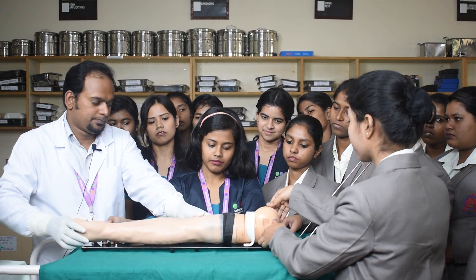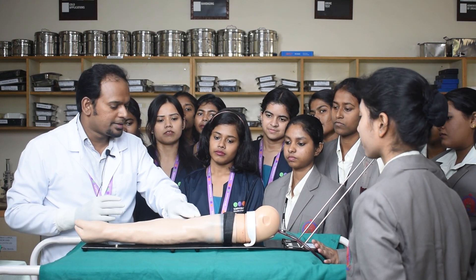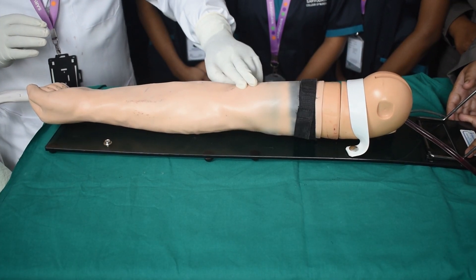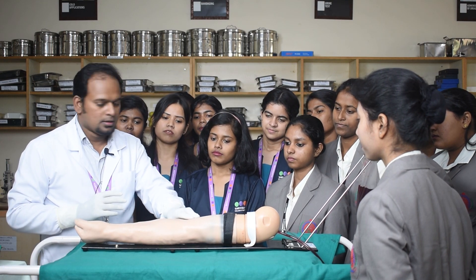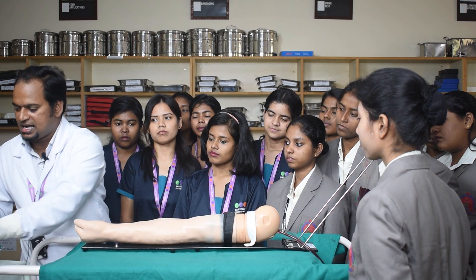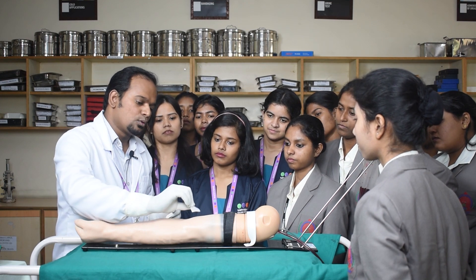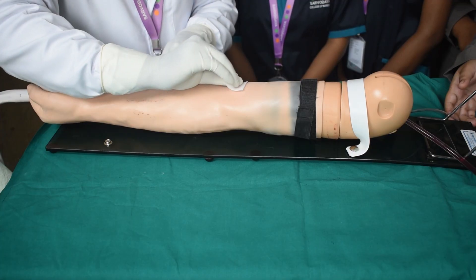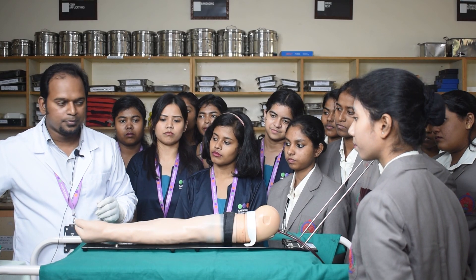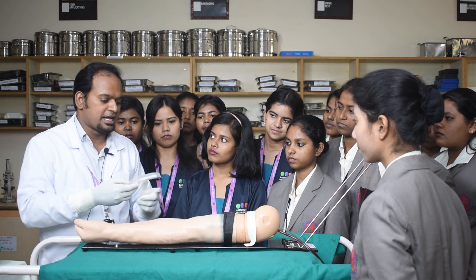The tourniquet is now tied. It is our duty to palpate the vein. I am palpating the brachial vein because we have taken the brachial approach — I can feel the vein very well. Now I am taking the alcohol swab. The purpose is to cleanse the area; we go from the center to the periphery in a circular manner. If needed, you can go for a second alcohol swab.